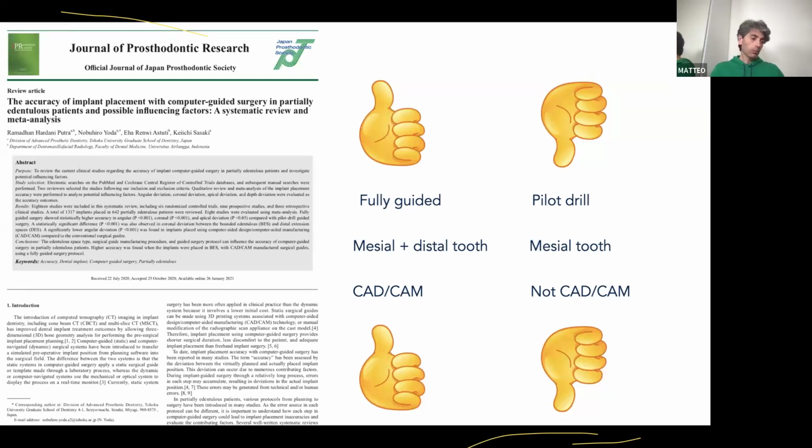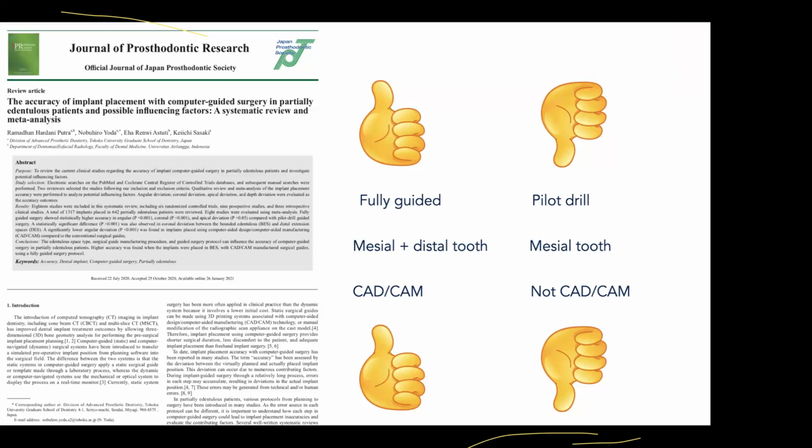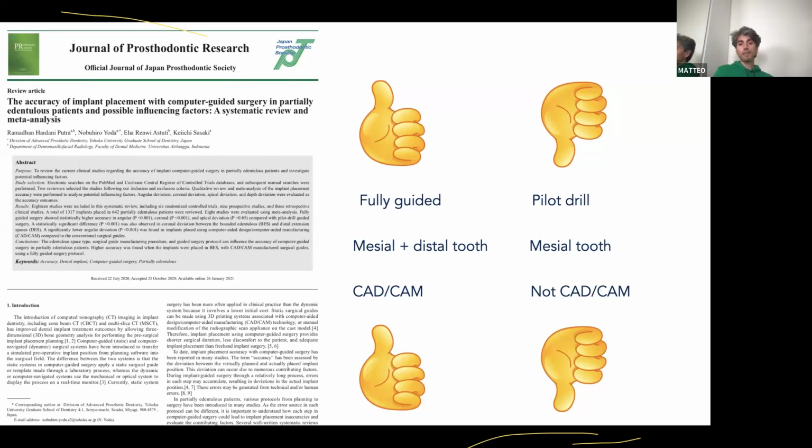With guided surgery, you have the possibility to do the fully guided surgery by using all the drills of the implants, or to use a partially guided surgery with the pilot drill, so to use maybe the first 2 or 3 drills of the system.